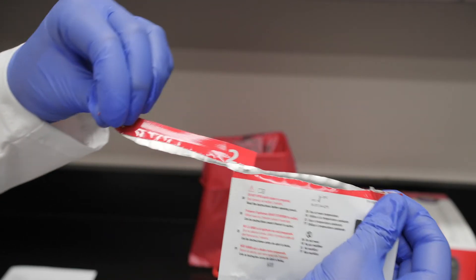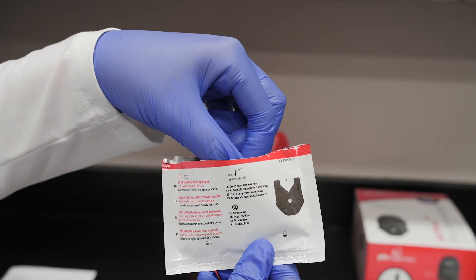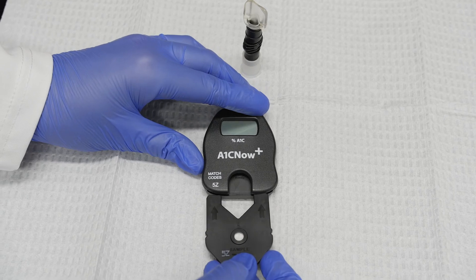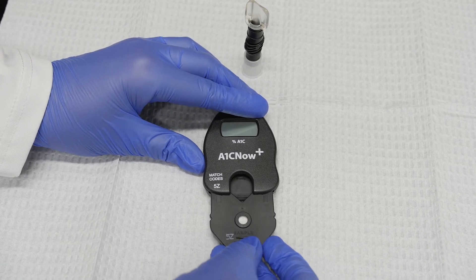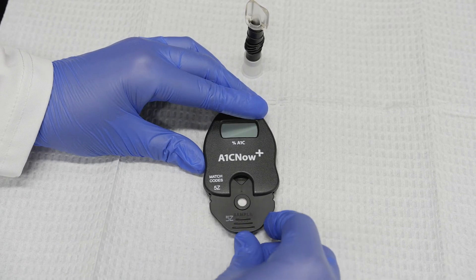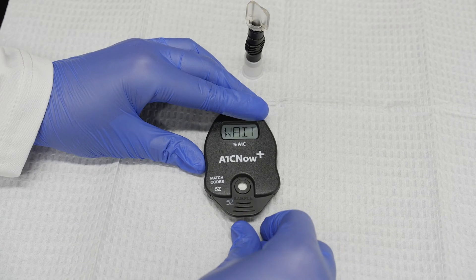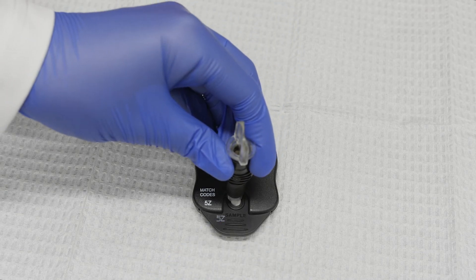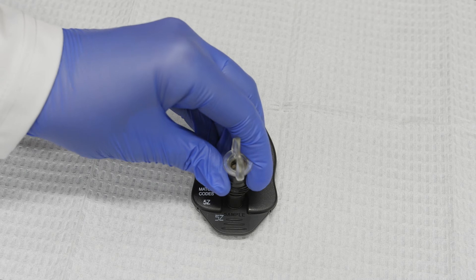Open the cartridge pouch. Remove the cartridge from the pouch and insert it into the analyzer. Ensure that the A1C Now Plus Analyzer is on a level surface. The analyzer will run through an internal self-test and display WAIT. Then remove the shaker base and, once the screen reads SMPL, dispense the control solution by pushing it down completely into the test cartridge.